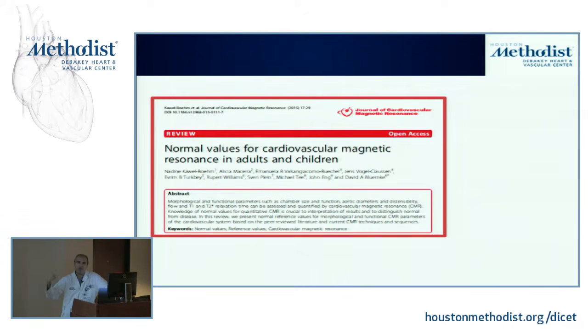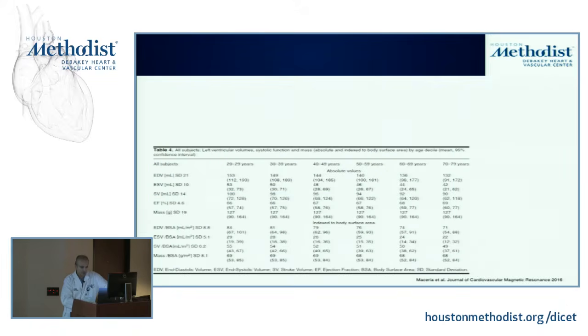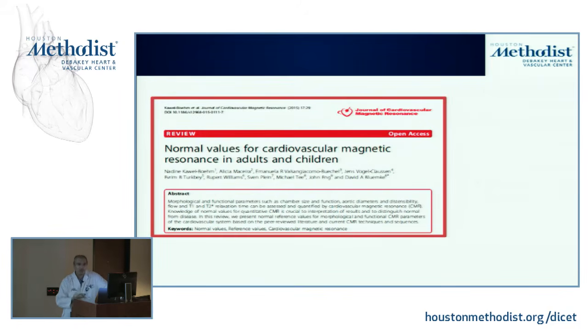And also, we have phase contrast techniques that allow us to measure flow in the aorta. That's another quality check that you do amongst normals: measure what is the stroke volume that you derive for your left ventricle by this planimetry compared to the measured aortic flow by phase contrast. Now, you mean stroke volumes, obviously. Stroke volumes, right. No, not end diastolic volumes, but the stroke volumes. Yep.